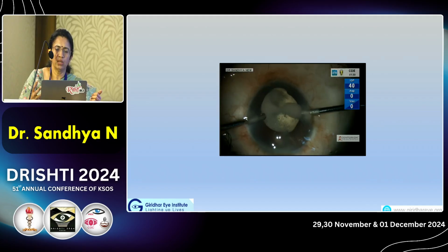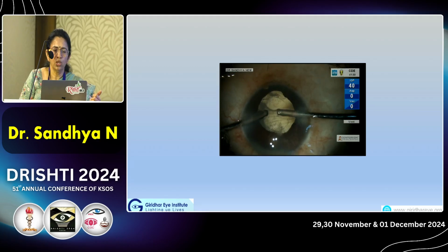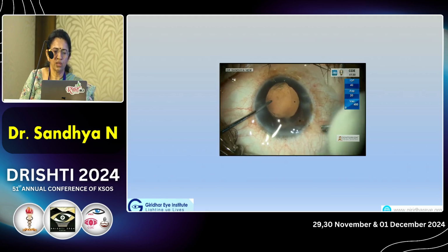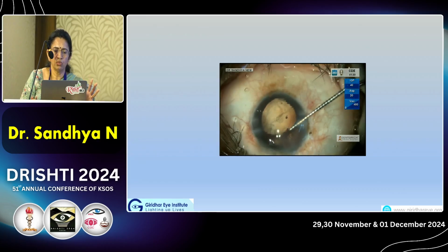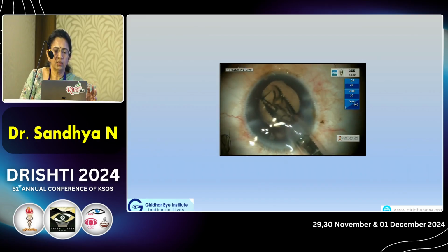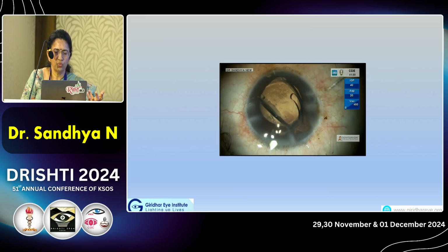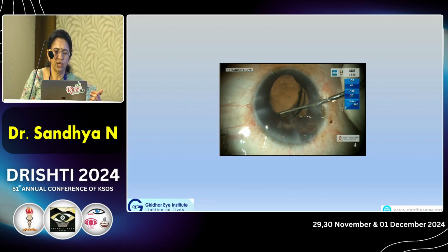Whenever the OVD was injected, the rexis margin was coming forward. So there was no vitreous in the anterior chamber. When the CTR was inserted, you can see there was ovalization of the rexis. But when it was inserted completely, it became round because of the stretch of the capsular bag equator. And then a 27 diopter lens was placed inside the bag. This lens was almost filling the anterior chamber, and it was slowly dialed into the bag.